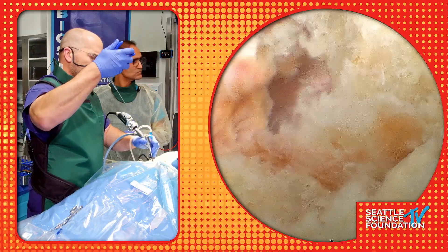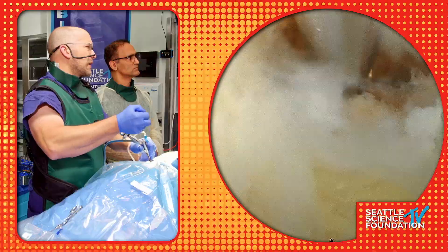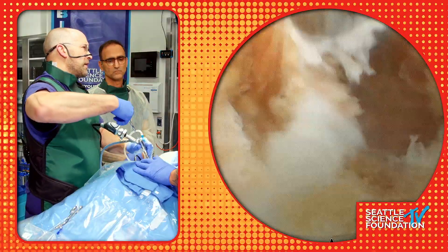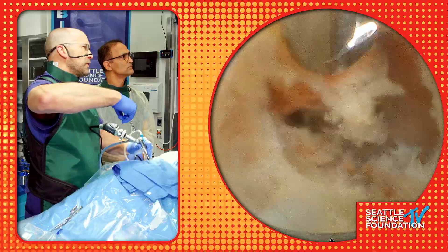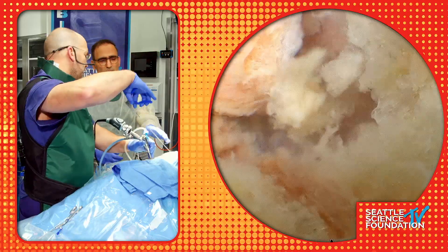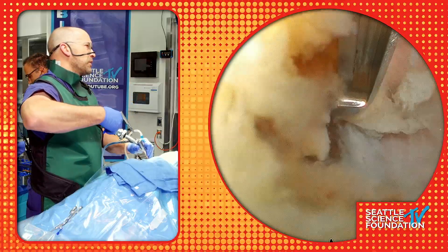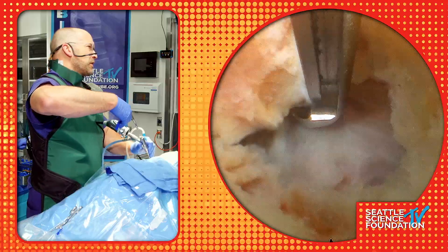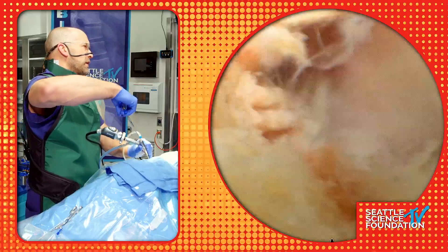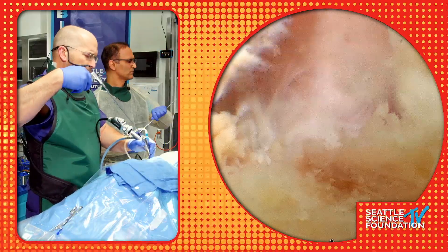In real life this would be like a bloodbath — what do you do to prevent that? The most important thing is you know exactly what your pressure is. The pump has a control where you can set the level and zero it. It's really important that the pressure is zeroed and that you have meticulous control of the little bleeders — you take care of every bleeder as they come, because the more bleeders accumulate the harder it becomes to control.